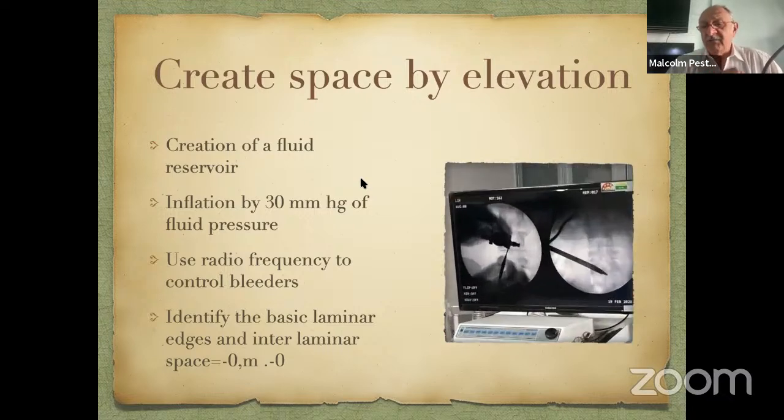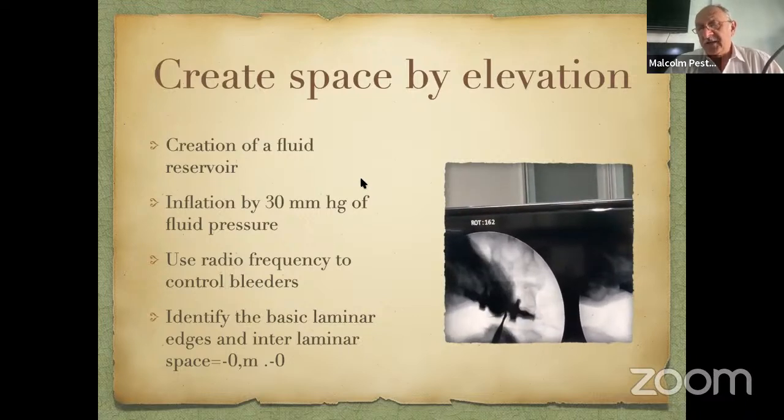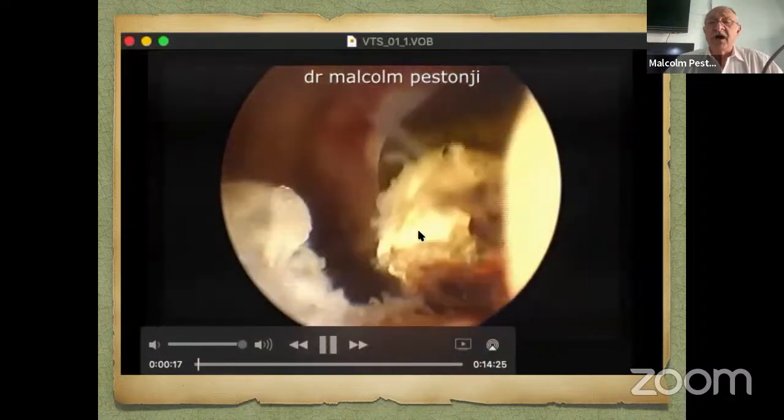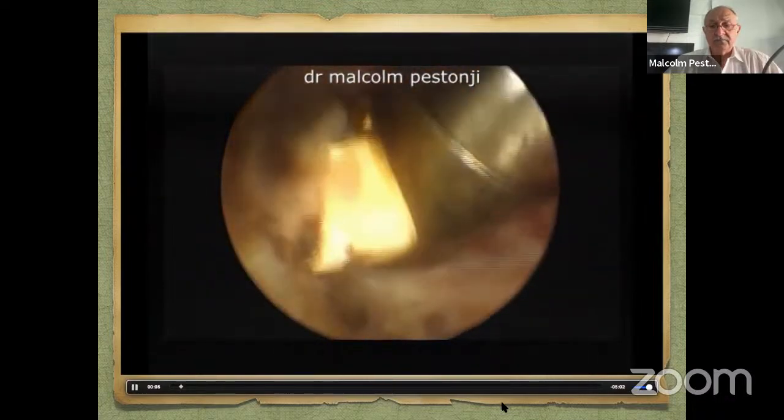This was the old technique by which we used to do triangulation, and I'm showing you an old technique. Nowadays, I do it with the tube directly. But you can see how the triangulation is occurring over there on the laminar surface. Now I'm going to play a video which shows how we strip. How do I do it serially?